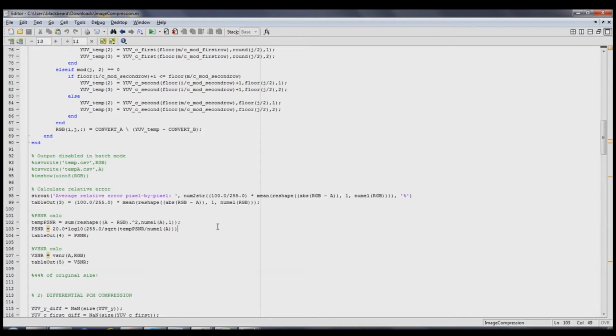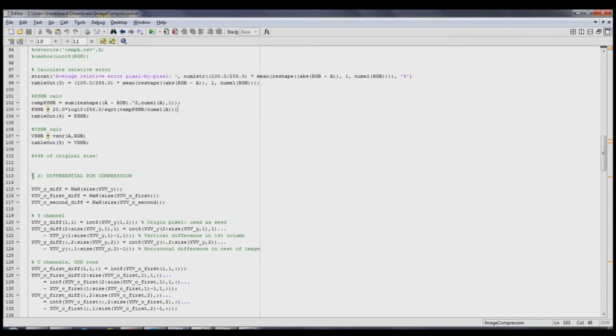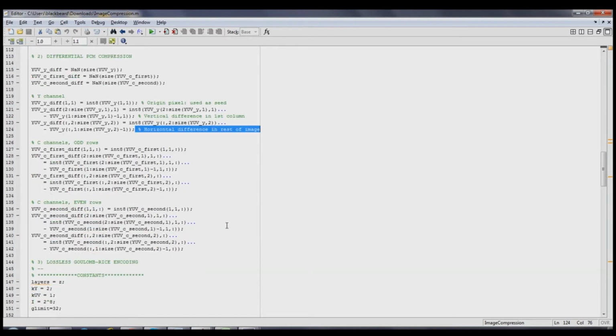So then next, part 2, taking the difference between adjacent pixels, we're doing it in 3 steps. The first pixel is our seed. Then we go down the first column and take vertical differences, and then we do the rest of the image using the vertical column as seeds for each row, horizontal differences.